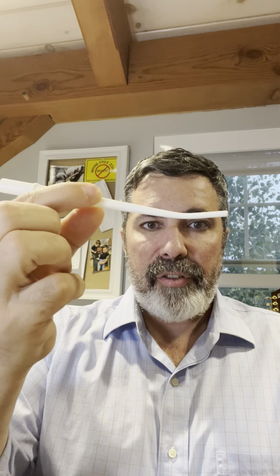Again, there's a lot more to this story. I'm trying to simplify it, but in general, deep bite cases here, everybody else back here, a saliva ejector will probably get you there, or a surgical suction. You can either use this tip here, or just find something round.